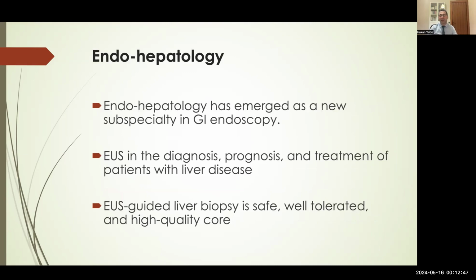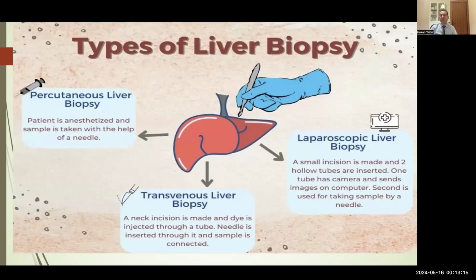In the new area, the endoscopy and the hepatopathology. Endohepatology has emerged as a new subspecialty in gastrointestinal endoscopy, used in the diagnosis, prognosis, and treatment of patients with liver disease. EUS liver biopsy is safe, well tolerated, and provides high quality core. Types of the liver biopsy.